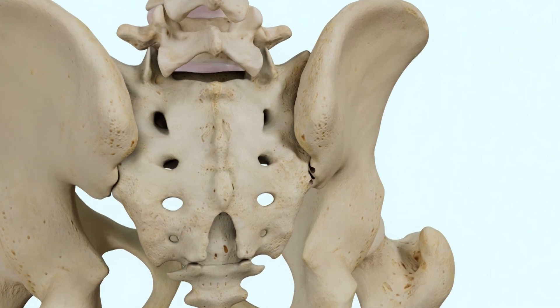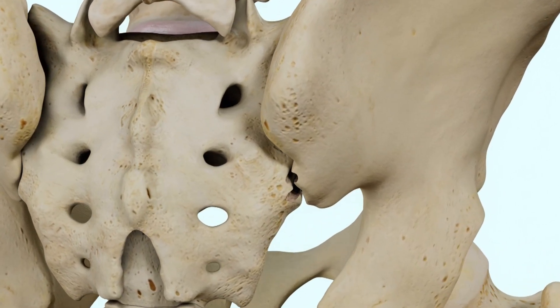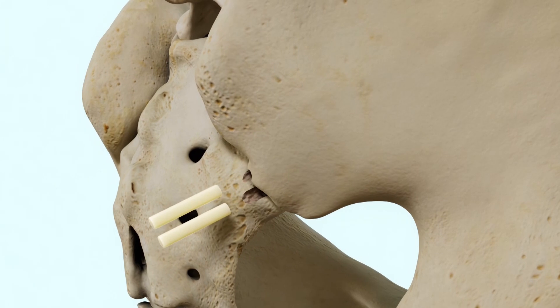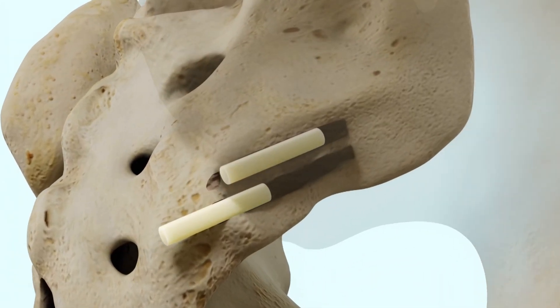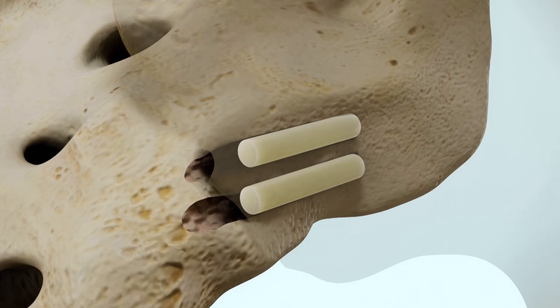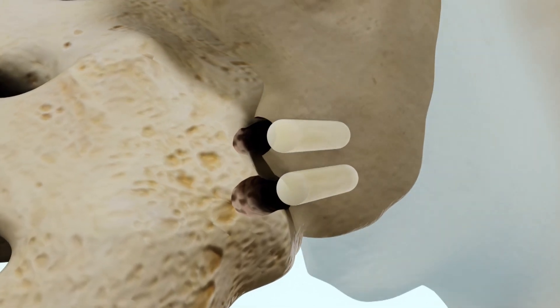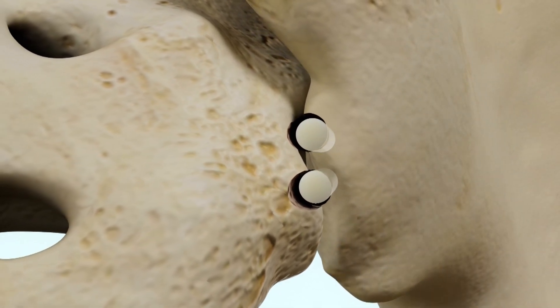Through a small incision in the lower back, two cylindrical allograft implants are inserted into the SI joint through a bone access needle. The allograft implants are designed to provide immediate stabilization and promote SI joint fusion.